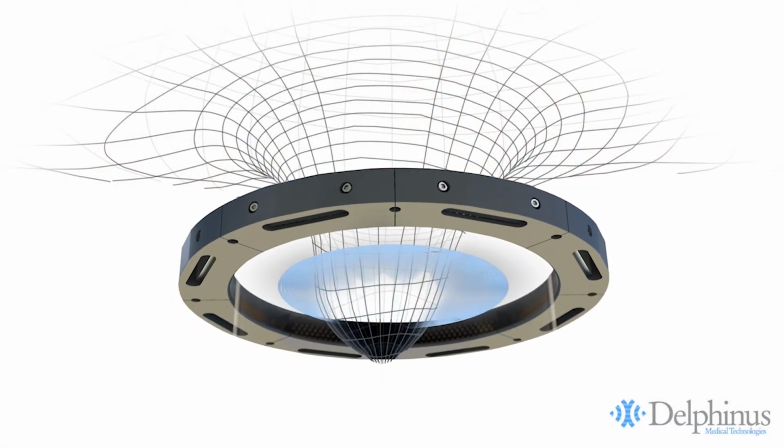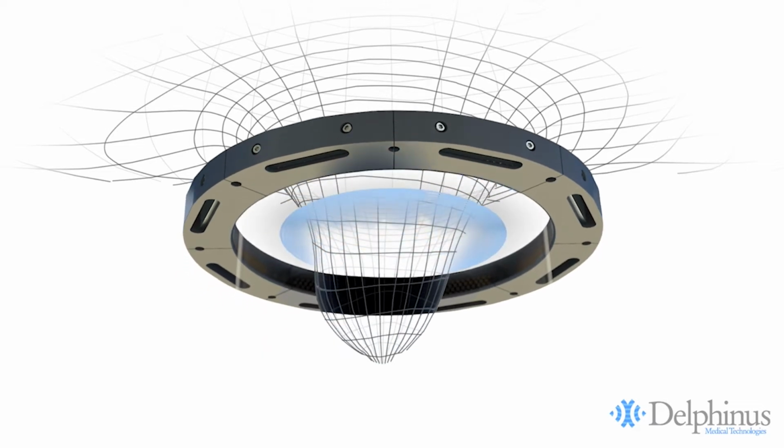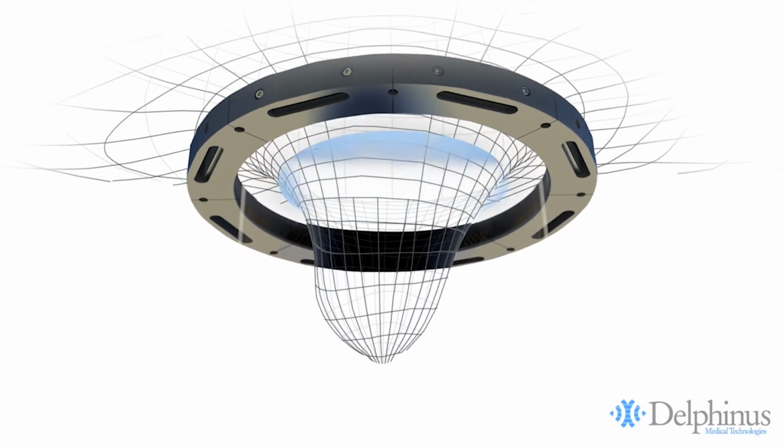The big difference with Softvue is that it also gathers transmission images. It actually shoots through the breast. The two things you get by shooting all the way through the breast is you can time it from one side to the other, speed of sound. You can then ask, is the strength of the signal the same? You can actually get attenuation. So those two are quantitative measurements. So instead of one way of characterizing, reflection, we've got three ways. And that's why we call it the triad of imaging.